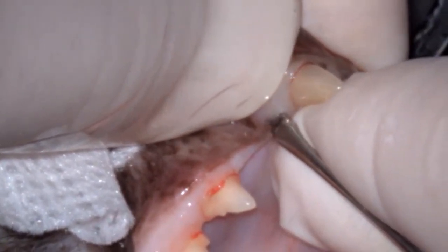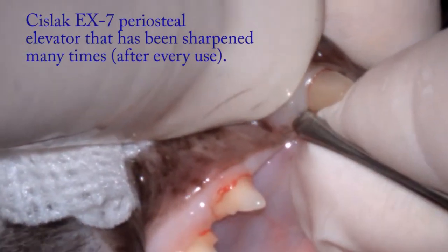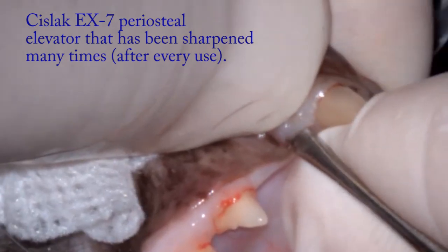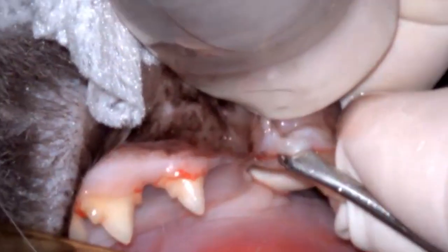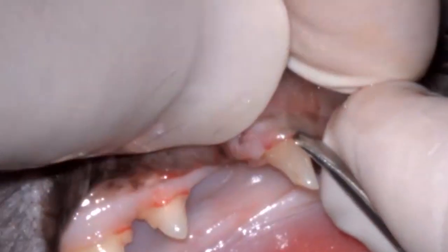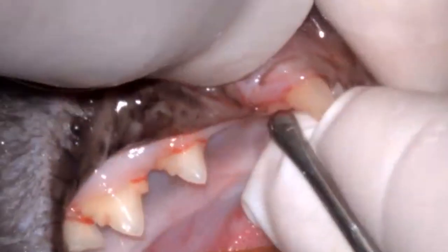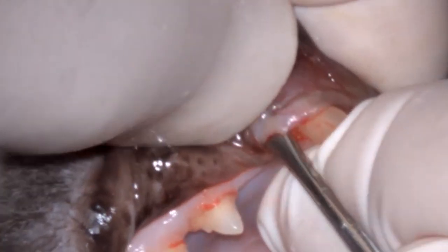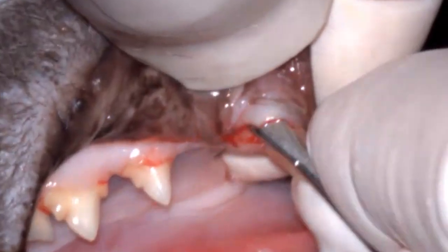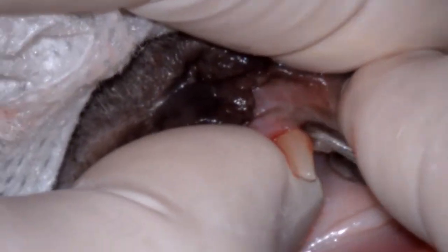The first step in extracting this tooth is to reflect a full-thickness mucoperiosteal flap to get the soft tissue out of the way so it can be protected for wound closure and to allow removal of bone. I'm using a Cislac EX7 periosteal elevator that has been sharpened many times — we sharpen our instruments after every use. The blade is widest at the tip and gets narrower towards the handle, so with each sharpening it gets a little shorter and narrower. At this point it has gotten down to a size appropriate for use in a cat's mouth. The instrument is kept so sharp that I can use it to make the incision as well as reflect the flap.